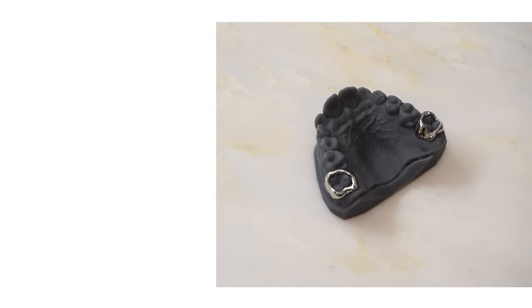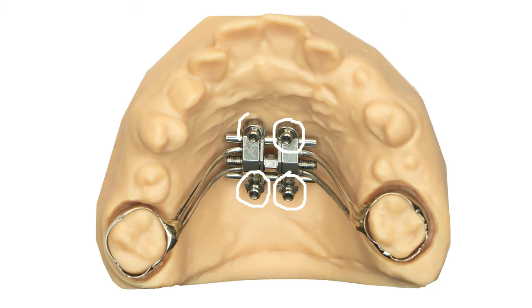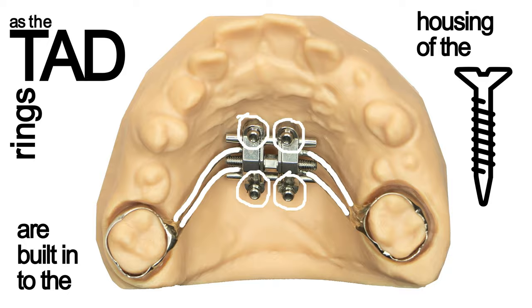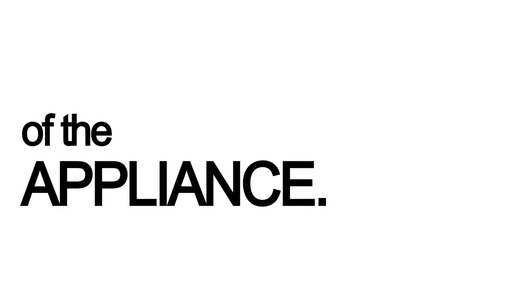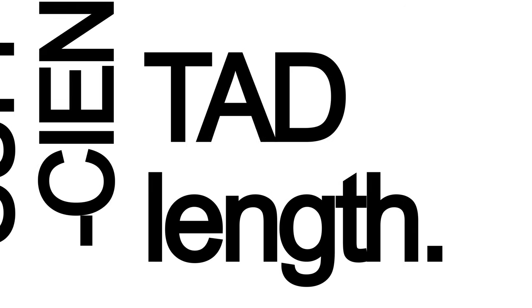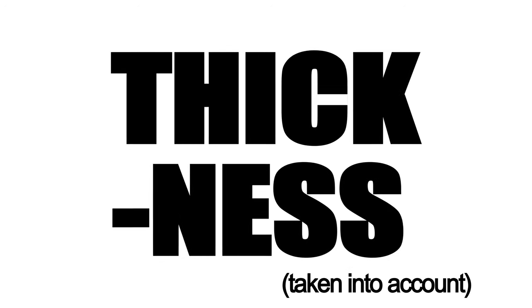3D printed bands for the first molars can be provided by the laboratory. The four TAD locations are predetermined by the expander, as the TAD rings are built into the housing of the screw. The four legs of the expander are made of soft wire and only aid as a guide for correct positioning and seating of the appliance. A transfer tray can be provided with the legs removed in advance if requested. Sufficient TAD length has to be considered, as there is a 2.5 millimeter housing thickness which has to be taken into account.